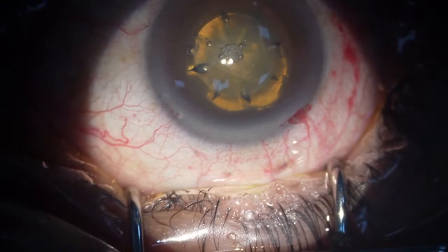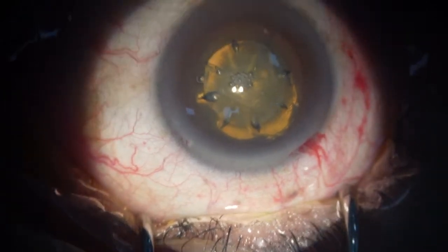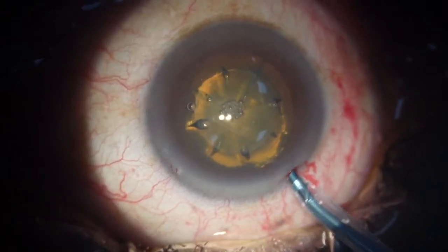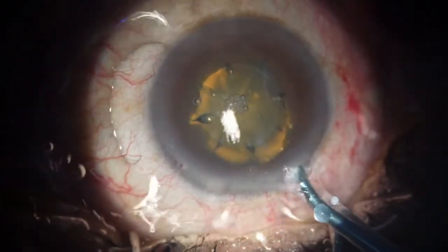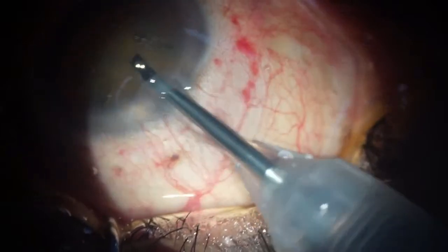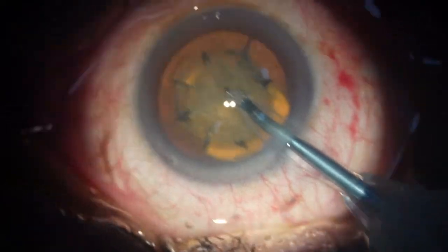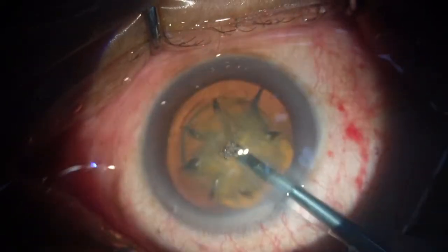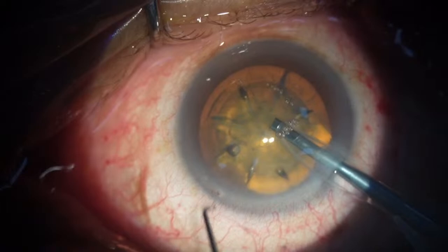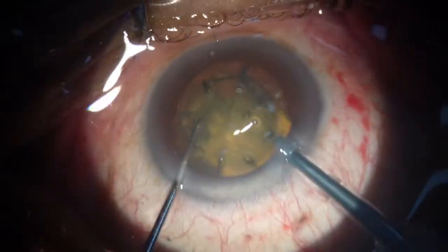I will go on to the phaco and as you can see the initial steps were just like a cakewalk. There was nothing which I had to do and I will now go in with my phaco. Because of the octants which I've made, I need not chop it properly, but I will definitely need to separate them. So I'm using the Signature Pro. Going in slightly tightly through the 2 point. Right. So here I start the aspiration, and as I aspirate, I get the capsulotomy, the free floating capsule out. I go in with my second instrument. I rotate it slightly.